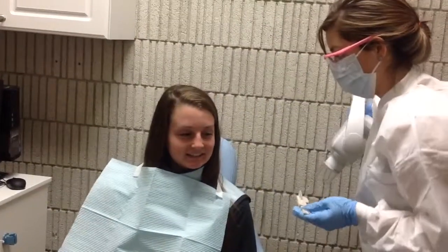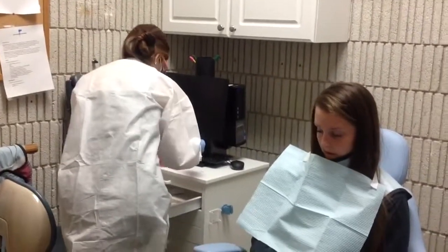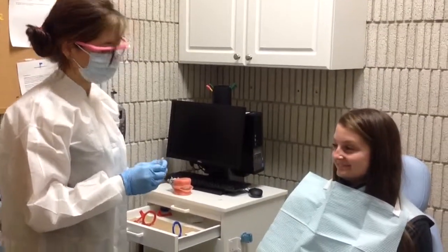How do you feel with that? Good. All right, not as bad as you thought, right? No. All right. So what I'm going to do now is I'm going to go take these films and I'm going to develop them, and we're going to show you with a light what your teeth look like. Okay. All right? All right.